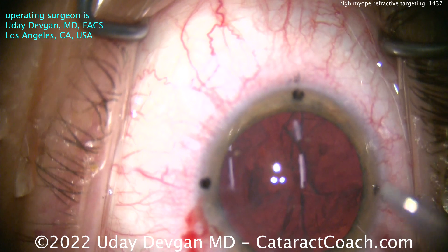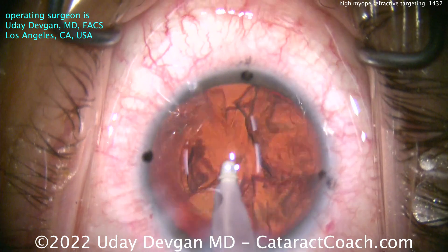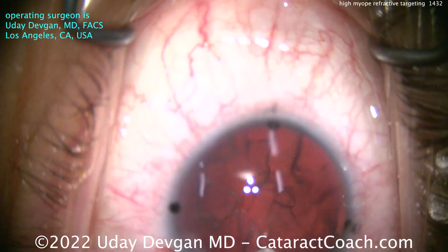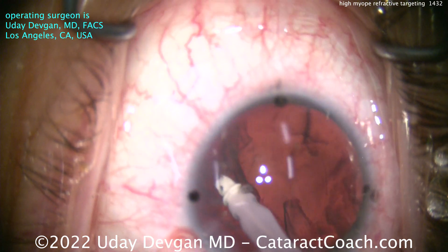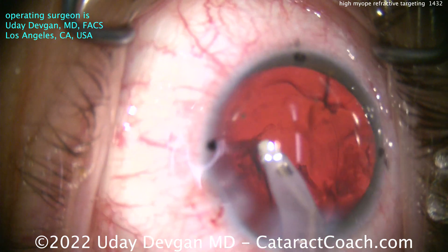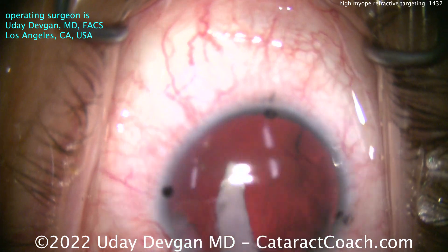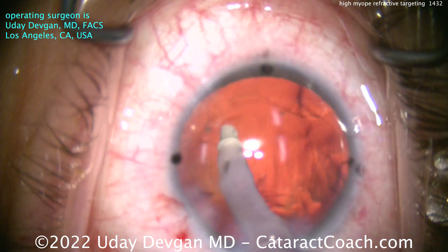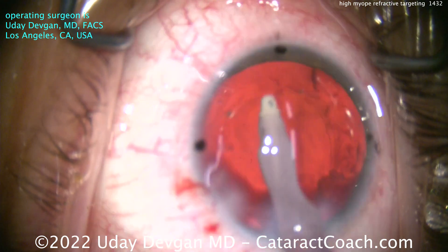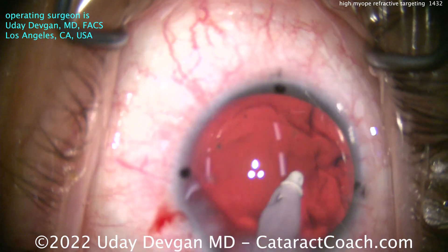At this point we'll clean up the cortex. Now you see the iris came back into view. But when you put the infusion in, you can again get that reverse pupillary block. That can help you get full exposure of the capsule bag, but you may also need to tent up that iris to break the reverse pupillary block, or alternately push down on the anterior lens capsule to return the eye to a more normal configuration and keep the patient comfortable. Cleaning up the capsule bag is certainly important, but don't go overboard on capsule polishing — these ultra-myopic eyes can have a weaker or more fragile capsule, and the last thing you want is a broken capsule.